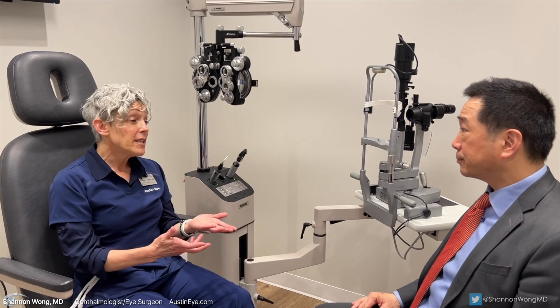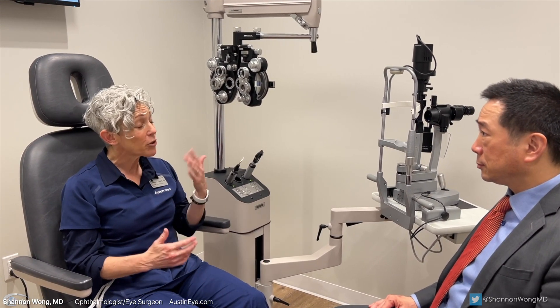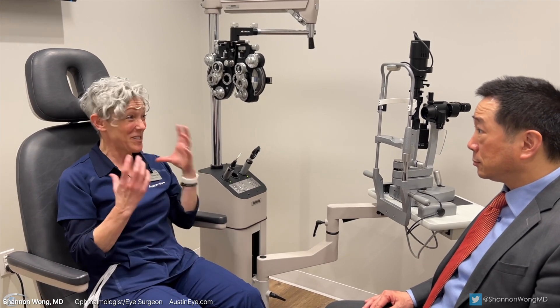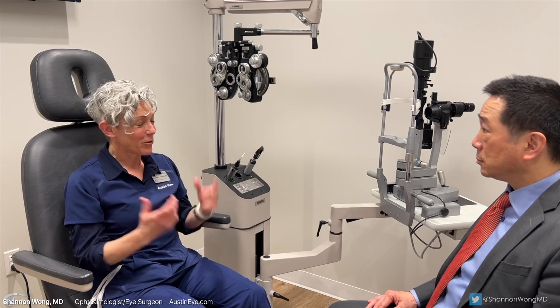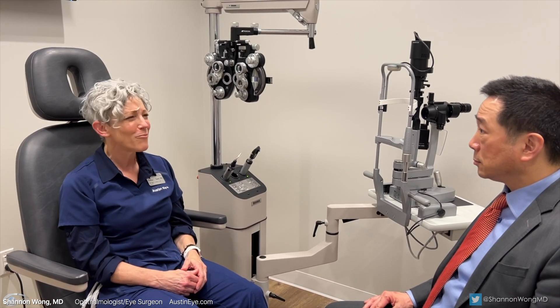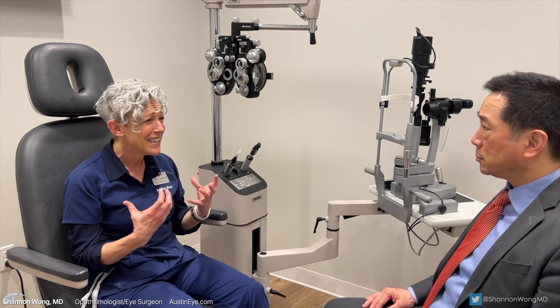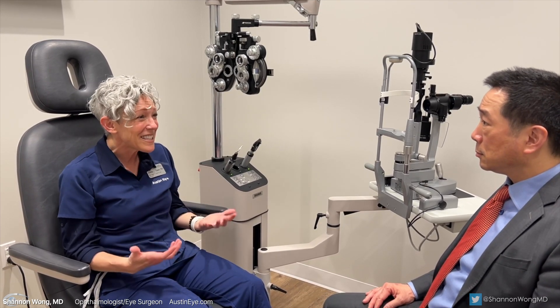The patient then returns to the surgeon still dissatisfied with their vision with the single-piece acrylic lens, wanting to achieve their desired refractive goal of great subjective and objective vision far, mid, and near without glasses — from the eye that has now already undergone YAG laser capsulotomy. The only lens design that will allow them to achieve their visual goal is still a single-piece acrylic lens.